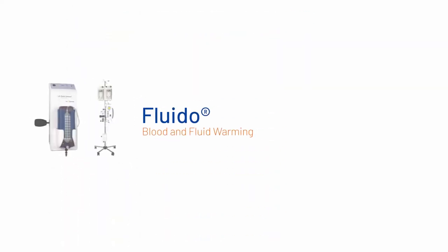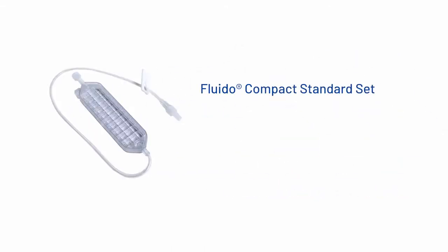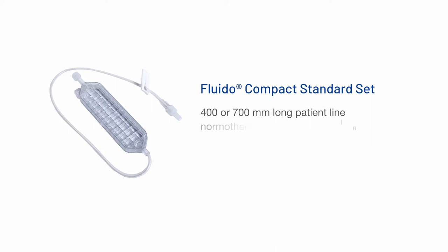Our portfolio for blood and fluid warming consists of two systems: the Fluido Air Guard system, with the capacity to warm up moderate to high flow rates, and the Fluido Compact, designed for warming low to moderate flow rates. The Fluido Compact standard set consists of a cassette, a 400 mm long patient line, and is also available with a 700 mm long patient line, a drip chamber, and an access point. The standard set can deliver normal thermic flow rates up to 100 milliliters a minute.